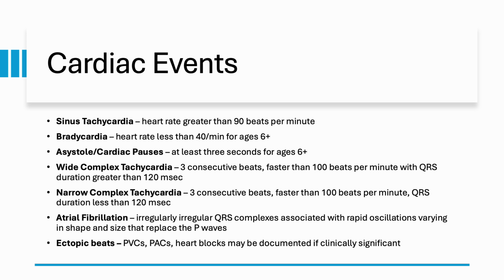Here are the scoreable cardiac events. Again, it's usually up to the sleep software and the provider and the report generator whether cardiac events are scored. The AASM says arrhythmias are scoreable. Also, remember, these are also while we're asleep. Bradycardia and tachycardia have different values for wake and sleep and for adults versus kids. Sinus tachycardia is just a fast heart rate, higher than 90 beats per minute. Sinus means it's still a normal heartbeat as far as the sinoatrial node is pacing the beat.